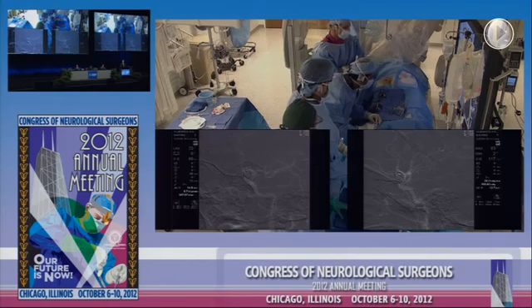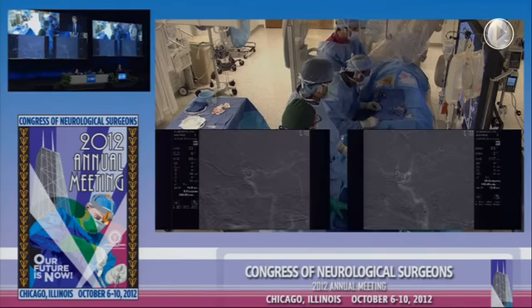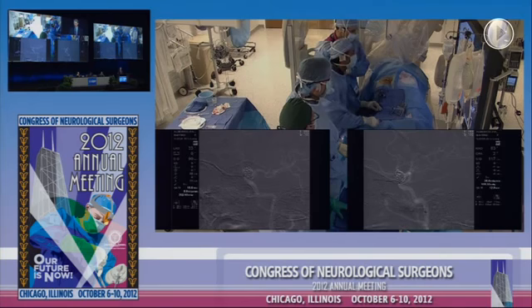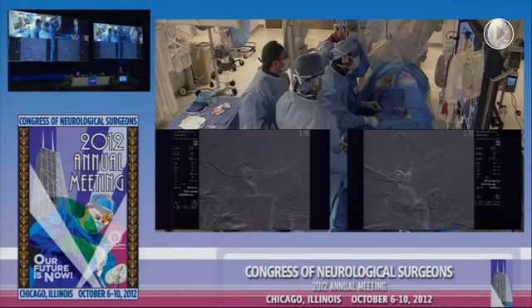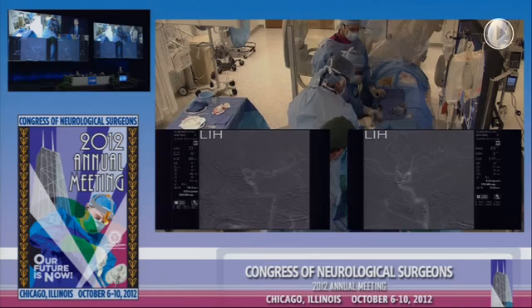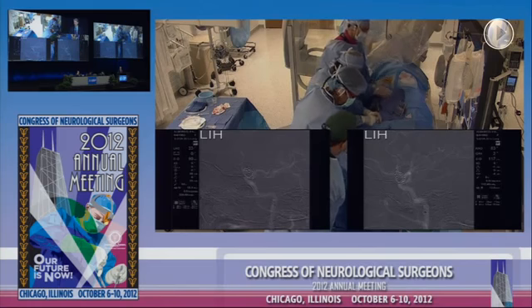You had a ruptured aneurysm with a big bleb on it that was high risk for re-rupture early on. And placing enough coils to fill the aneurysm, without worrying about getting tight compaction and not having to worry about placing a stent, which requires aspirin and Plavix at the time, is a nice way to temporize. And then you can let the patient stabilize, obviously a very sick patient, and then come back in a more leisurely fashion. And that's what we're doing here.